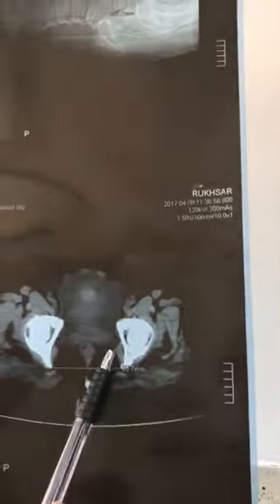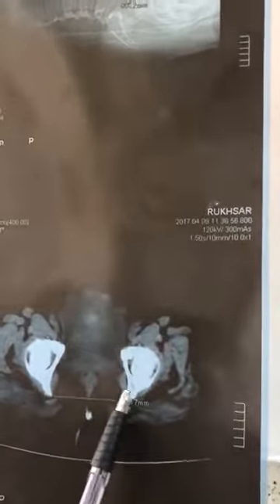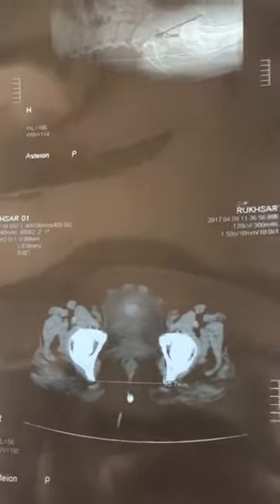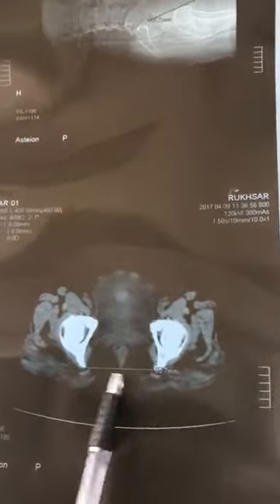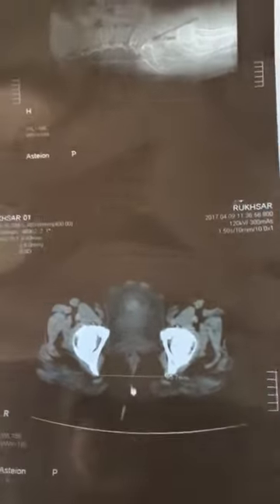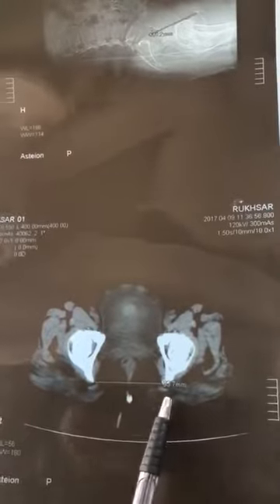This is the transverse diameter of the pelvic outlet — the interspinous diameter, which is also called the transverse diameter of the outlet. This is 9.3 cm in this case.